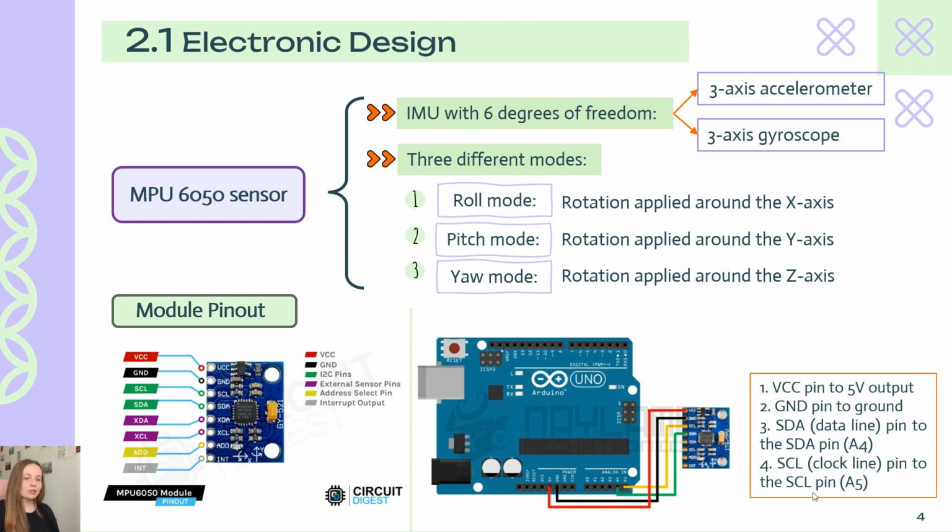Regarding the sensor that we used, as I said, it was an MPU 6050. This is an IMU with 6 degrees of freedom that integrates a 3-axis accelerometer and a 3-axis gyroscope. Based on which axis the angular rotation is applied, we have three different modes: roll, pitch, and yaw. In the first image, we can observe the pinout of the sensor, and in the second one, the connections necessary for interfacing the Arduino with the sensor.